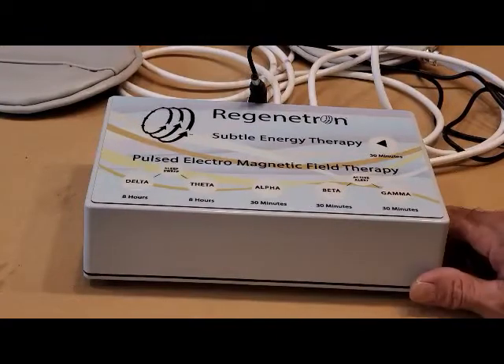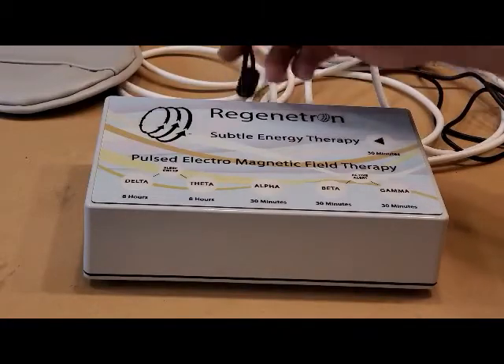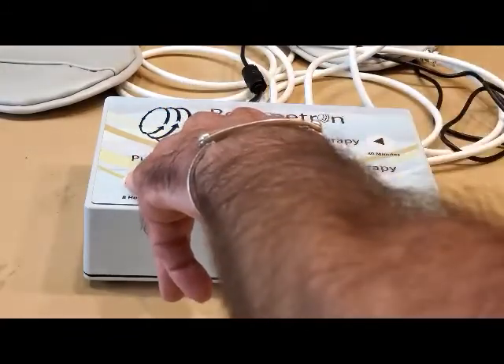Today I will be demonstrating how to reset the Regenitron Subtle Energy Therapy device. Start with your unit unplugged, hold down the Delta and the Theta button, and go ahead and plug your unit in.